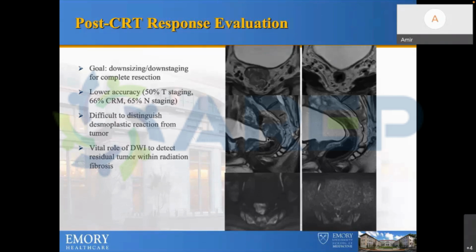The ultrasound gel is actually ideal if you can use it, but some places use a certain brand of gel that is used for vaginal or rectal use. Similar to dynamic pelvic floor studies, they put gel inside the vagina and also inside the rectum. That's the same type of gel. There's nothing specific about it. It's just expense. Some of them are more expensive, some of them are less expensive.